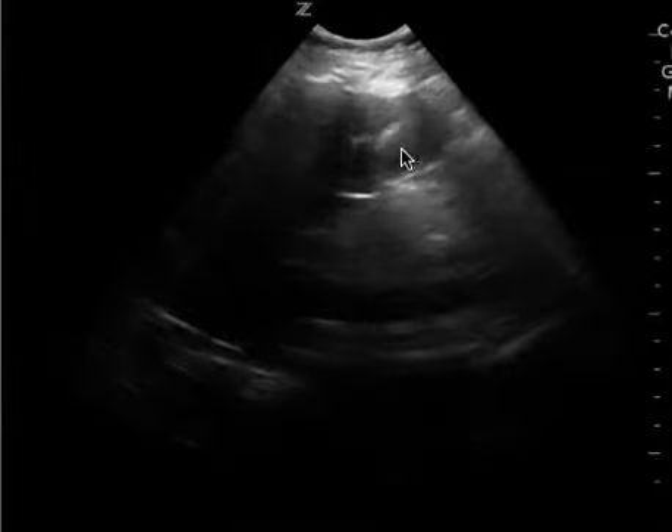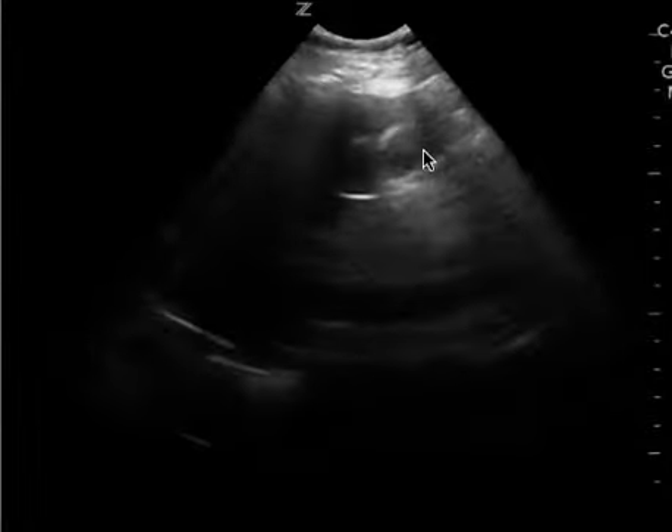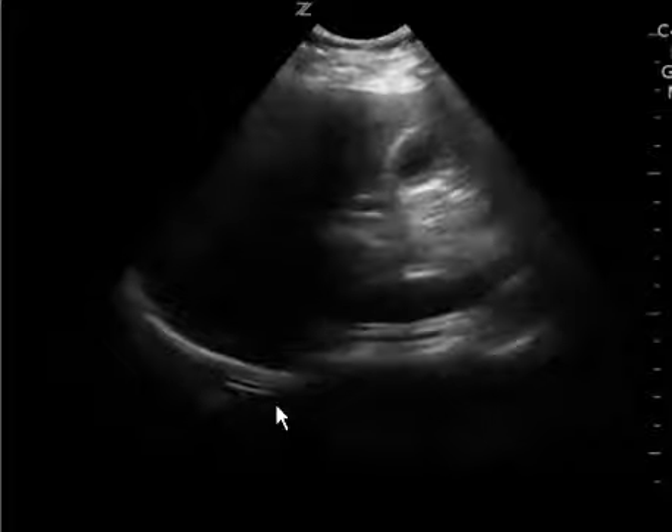It looks contracted, and so maybe possible wall thickening, but it's too hard to tell if there are any stones or what's going on, mostly because the gallbladder is contracted. So to me it's a limited study.